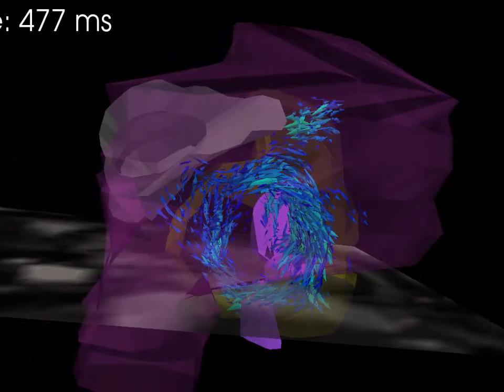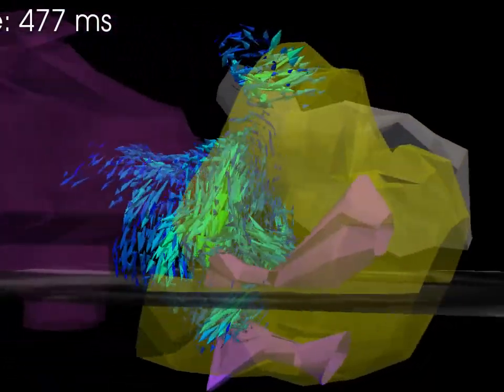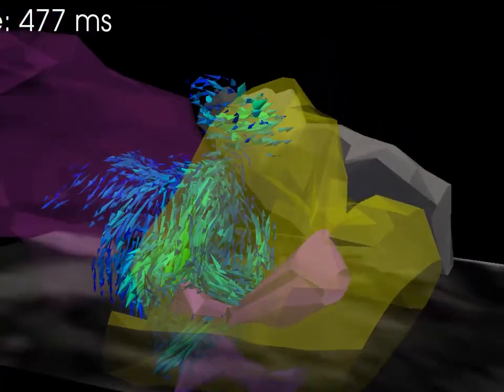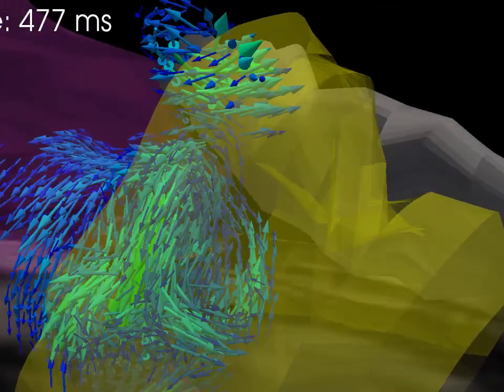Note the position of the papillary muscles, which supports this. However, accurate segmentation of the leaflets will be needed before conclusions can be drawn.